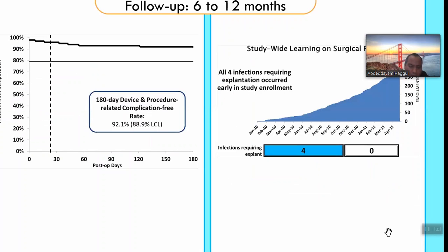At 6 months of follow-up, complications were observed in 8% of patients. There were 4 cases of infection of the compartment which required extraction of the material. This complication was particularly observed in the early stage of the learning curve for implanting cardiologists.